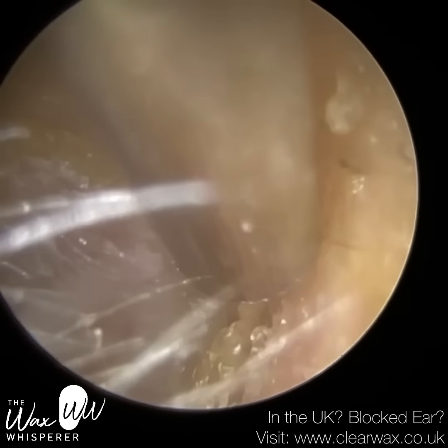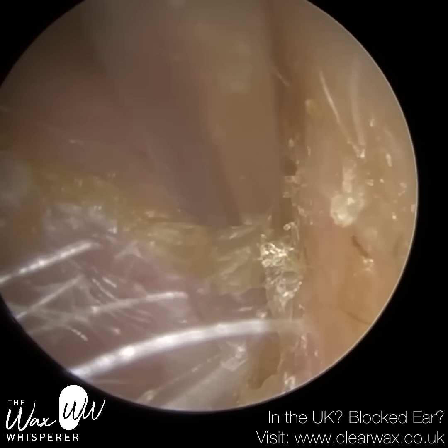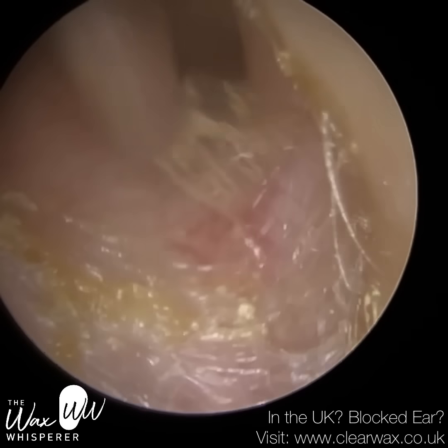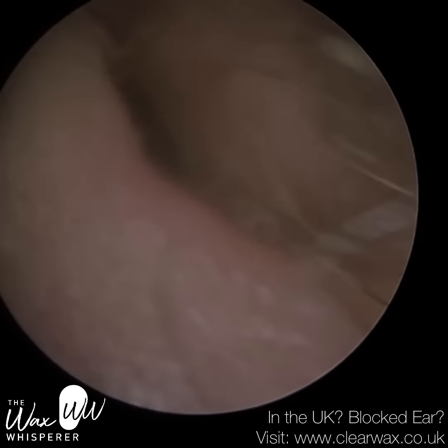So I just want to peel away, and we're almost there. See, the skin is extremely dry. I would advise the patient to use medical grade olive oil on a regular basis, just to help hydrate the skin and to lubricate it.